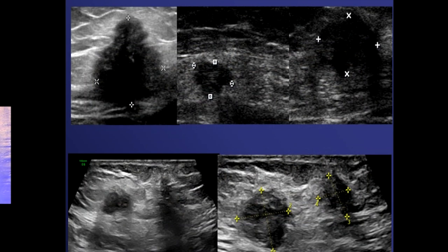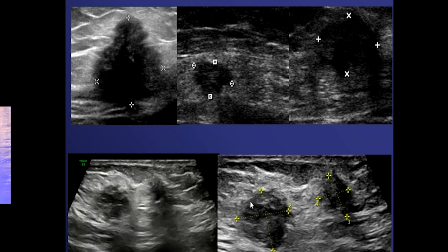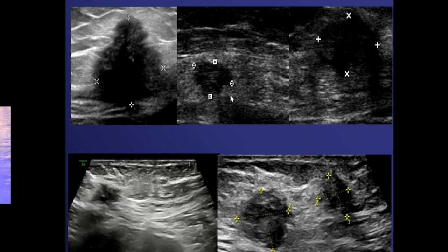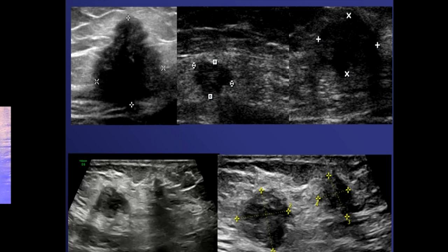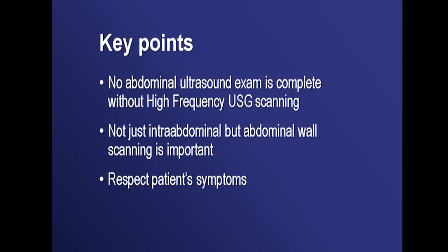Rectus hematoma is typically seen in patients who are coughing repeatedly. Scar endometriosis occurs in post-operative patients presenting with pain during the menstrual cycle. It is very important to differentiate whether the lesion is only in the subcutaneous tissue or also involves the rectus muscle, because surgery requires removal of that chunk of rectus muscle when it is intramuscular. Scar endometriosis can appear as a solid or multiloculated cystic lesion. Always document whether it is subcutaneous, subcutaneous with rectus extension, or exclusively within the rectus muscle.